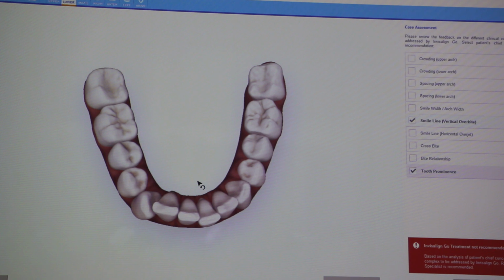But you could fix that, Doc. How long would it take? How many aligners did that take? Right. 9 months, so 30, 35 aligners, something like that. So are you getting the distinction I'm talking about? The difference between a green movement versus non-green?